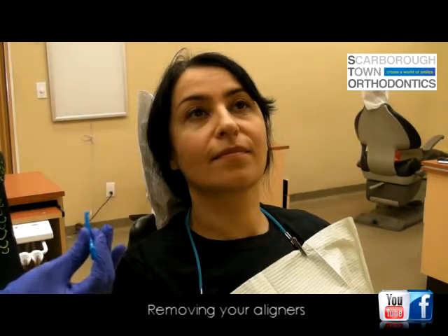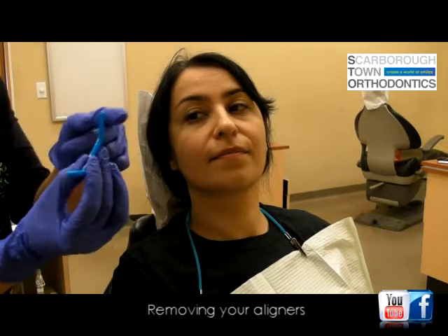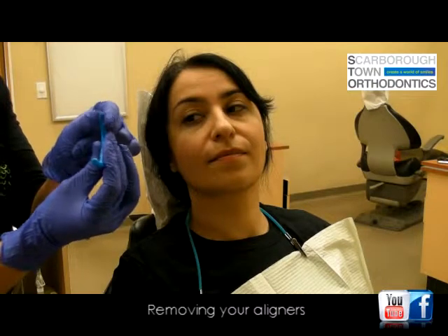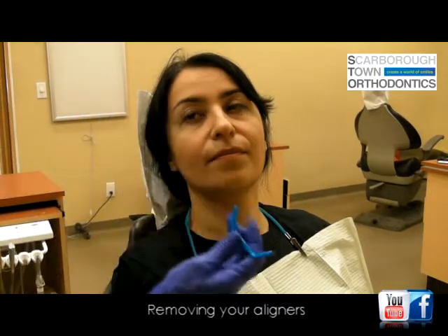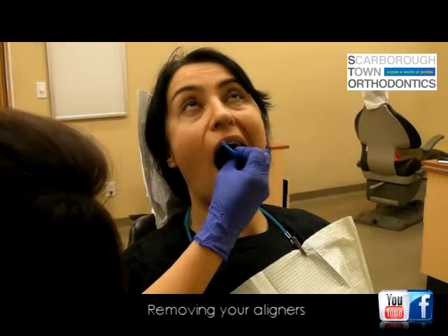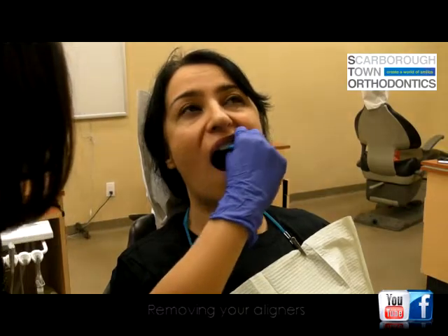If you have short fingernails, you might have a hard time getting your aligner out. So we will provide you with this little blue tool, and the edges of them have a hook shape on the end of it, and this is just to help you grab the edge of the aligner. So I'm going to show you on Faye right now. You're going to use it to just hook the inside at the very back, and once you get a good grip, you can pull and remove the rest of the aligner.